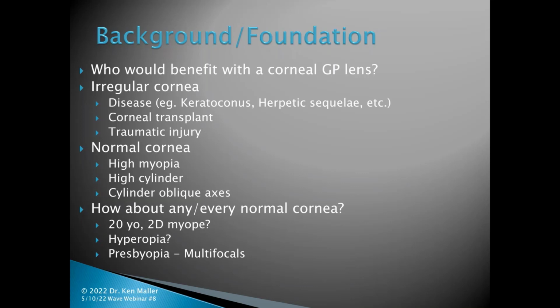Hyperopia? Well, hyperopia is a little tougher because you have the plus, which increases the center of gravity and the weight of the lens further forward, which possibly has the lens fall. So it's a little tougher to position. But I would still submit that hyperopes can benefit tremendously. And as far as presbyopes and multifocals go, gosh, this is a godsend. This lens can really outperform virtually everything else on the market for the presbyopic market. So this is a fantastic device for the presbyope.